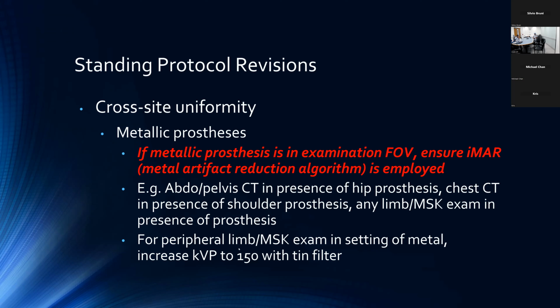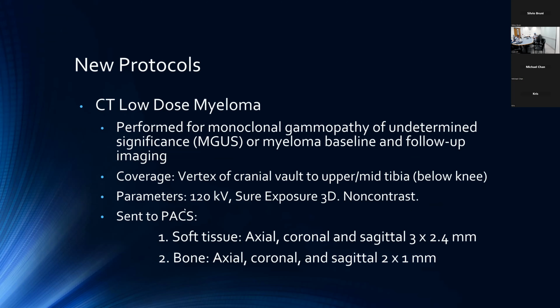So we'll start applying that as well, and then that can also have the IMAR algorithm applied to it after the fact. So in terms of some of the new protocols that we've introduced as of late, the first you may have already encountered, which is that low dose whole body myeloma screen.